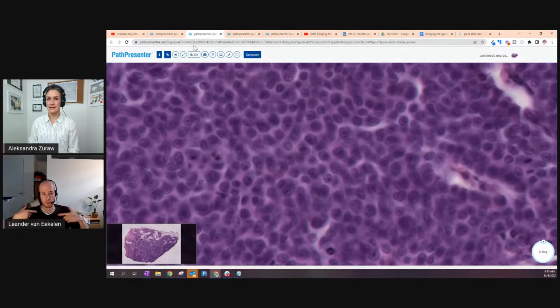Sure. If you consider the actual process that goes into training these models, you always need data. And we all know that collecting data for training these kinds of systems is very expensive, mostly time-wise. You're asking a medical expert to do a complicated yet repetitive task for you. The nice thing about object detection is that it's a lot simpler in terms of annotation, or generating the labels, than semantic segmentation, because then you have to draw a line. It goes even further for instance segmentation, where you, as the annotator, the person making these labels, have to actively segment every object.